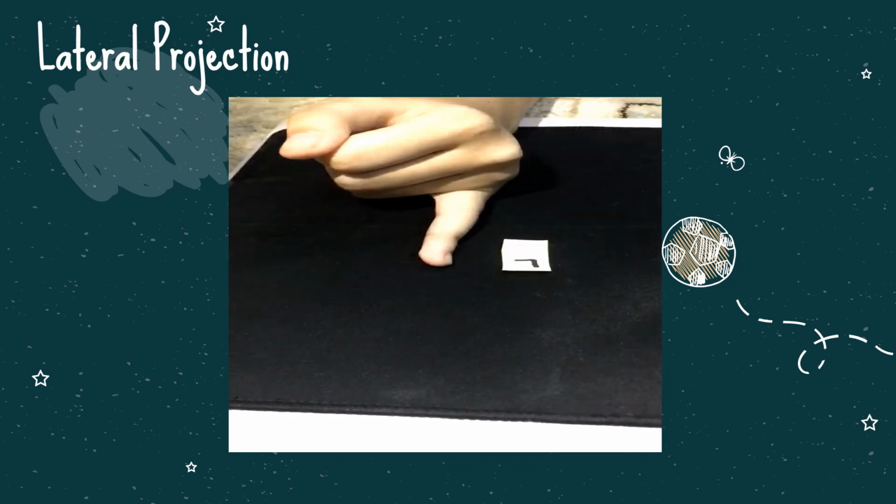The central ray must be perpendicular to the IR and directed to the PIP joint, with a minimum SID of 40 inches or 100 centimeters. Collimate on four sides of the affected finger.